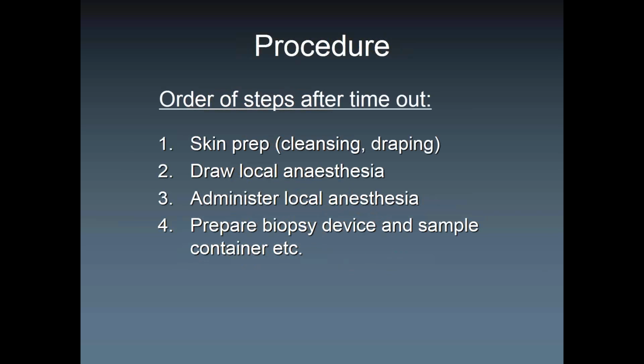Okay, it's important to have a routine when you set up your procedures, because a routine can help you, number one, to not forget things that are important, number two, to be more efficient, number three, also to help the patient. I'll tell you in a minute why. So this is a four-step workflow that helps the patient because it takes advantage of the fact that local anesthetics take some time to kick in, okay?